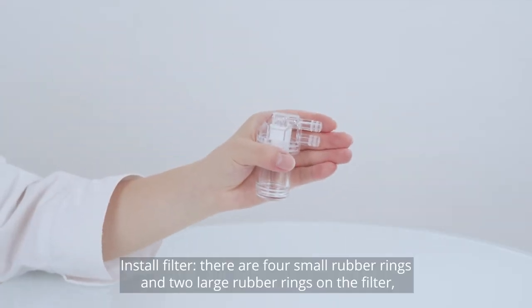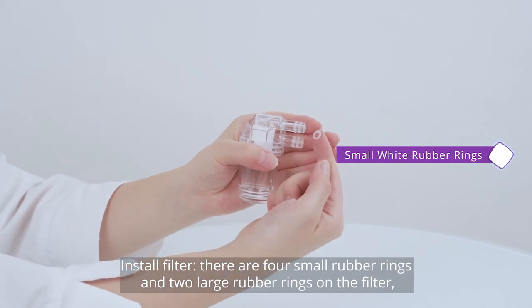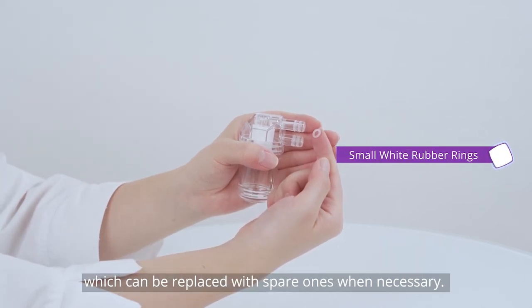Install a filter. There are four small rubber rings and two large rubber rings on the filter, which can be replaced with spare ones when necessary.